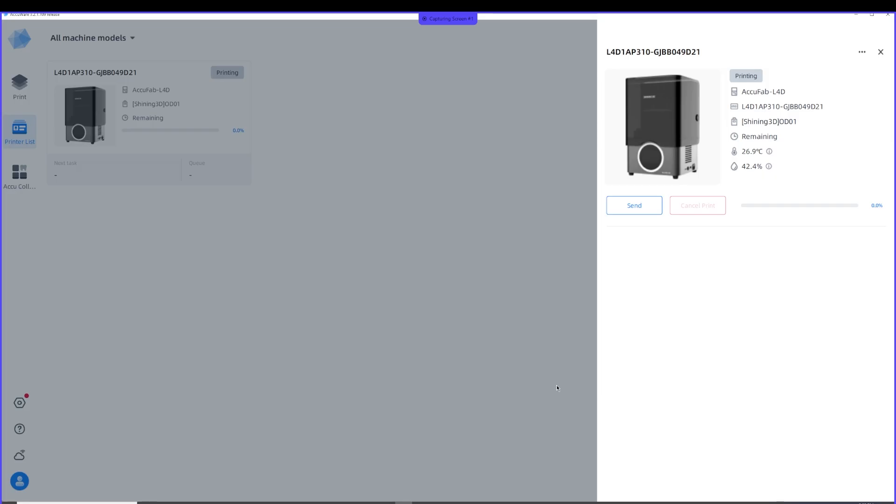Now it's printing. You can walk in and check your printer and make sure it's printing. You can actually close out of AccuWear once the print job is completely sent over to the printer.